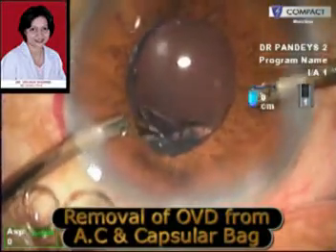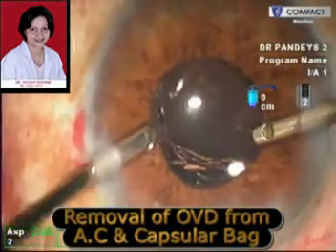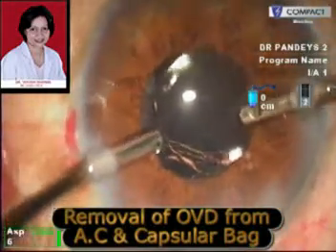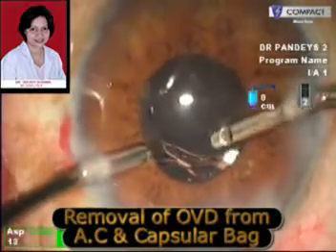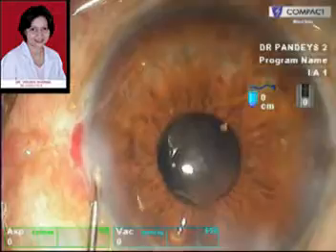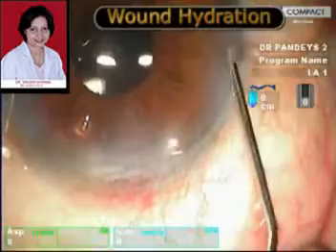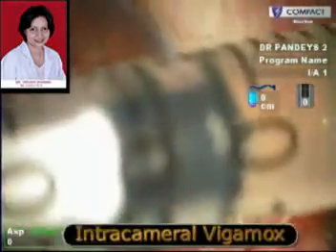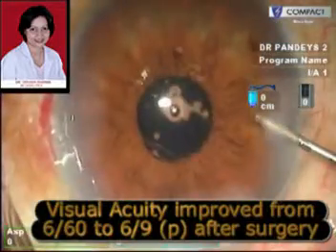The viscoelastic device is then removed from the anterior chamber and the capsular bag, and also some small bubbles of silicone oil can be removed during this irrigation-aspiration. The wound is then hydrated, the IOL is well centered in the capsular bag, and the cornea looks clear at this stage.